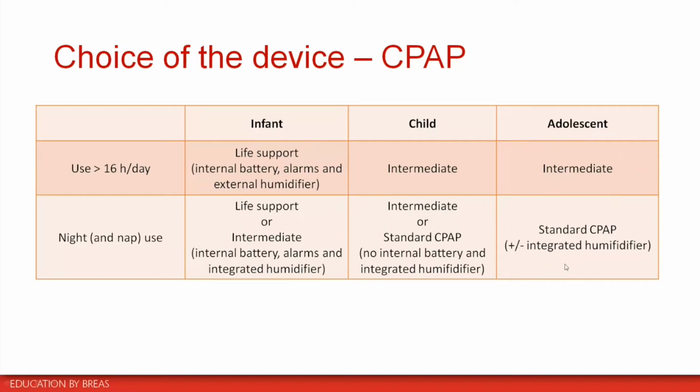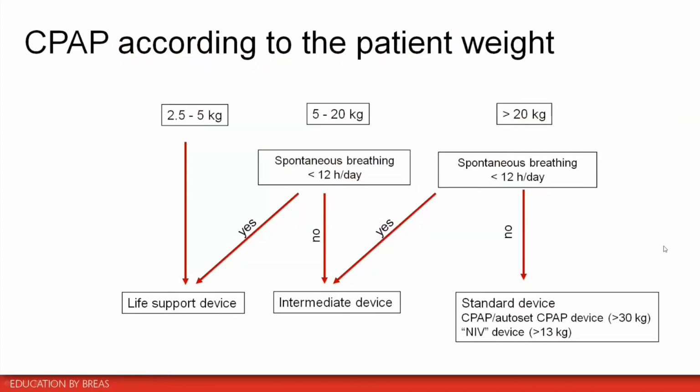And if it's only for night, maybe sometimes for nap in some adolescents, but usually it's only for night, we will go with a standard CPAP. Usually our practice is to propose the humidifier, but that can be a discussion. So this is another way to see what we are usually proposing for our patients. But once again, you have to do what you feel is best for the patient and what you feel comfortable with. So this is only an indication of our practice.